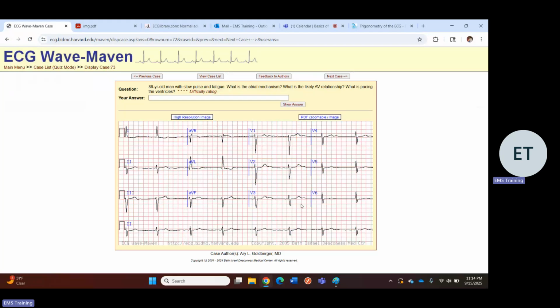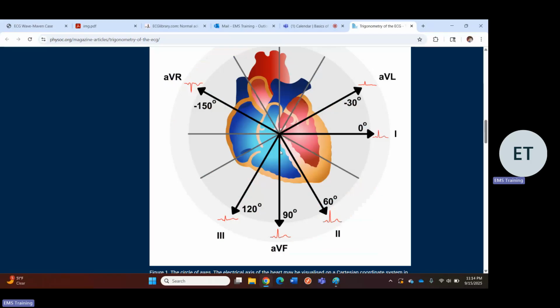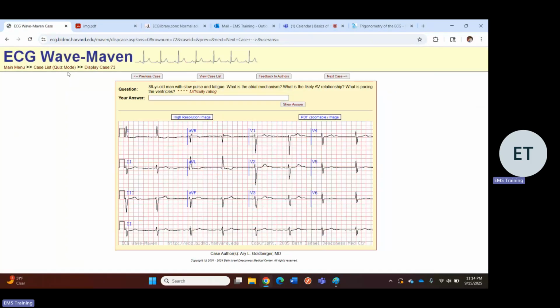And because there's no P wave, what's pacing this? Well, it's not super wide. So this is a junctionally paced rhythm, probably. High junctional, because this isn't super wide. So the pacemaker of the heart is coming from the junction, I do believe. And it's maintaining somewhat of a normal rate. So it would be unlikely that a rate of almost 50 would be causing severe hemodynamic compromise. This is probably high in the junction instead of coming down in the septum. Well, I'm going to say this patient has a calcium issue. Ka-chow.